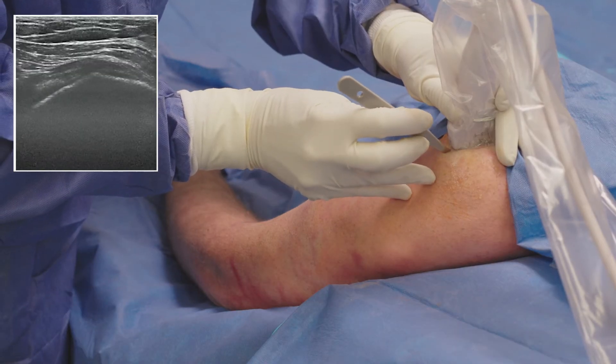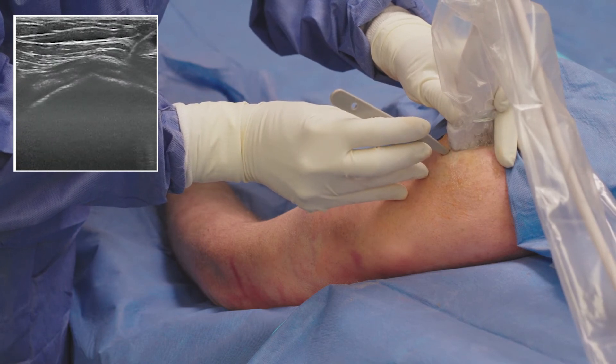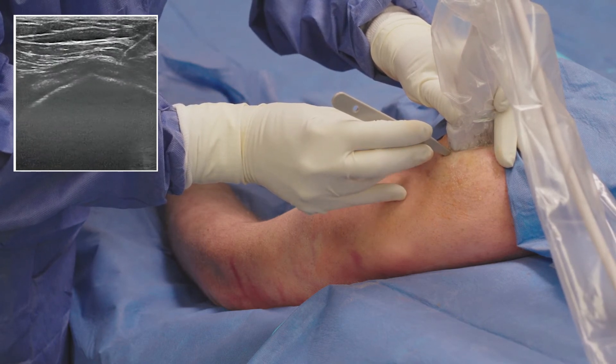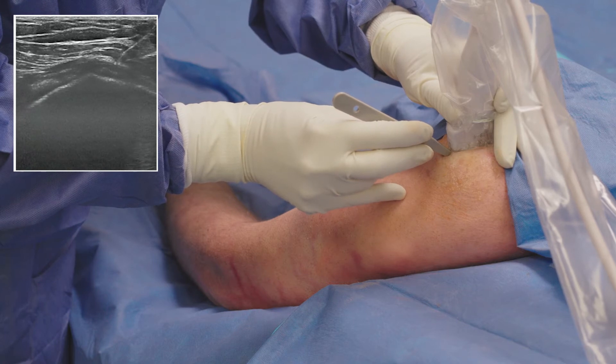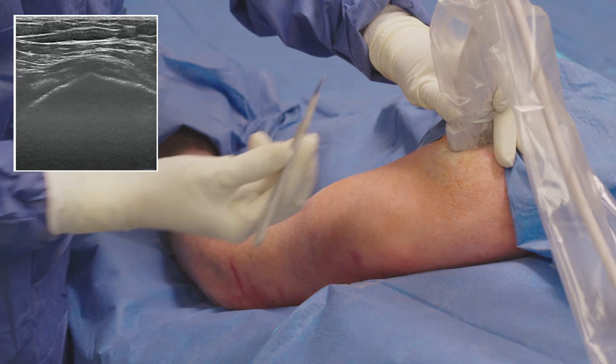I then plan the shortest direct approach to the tendon. Using an 11 blade scalpel and holding the sharp edge away from the ultrasound probe cover, I make a small stab incision down to the tendon just contacting the bursa.